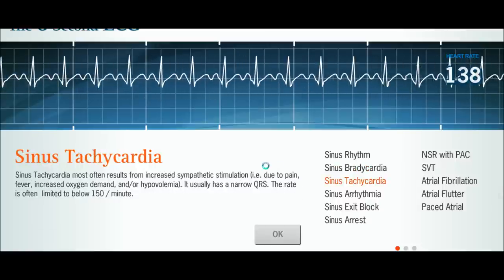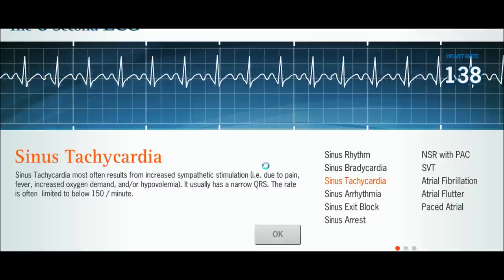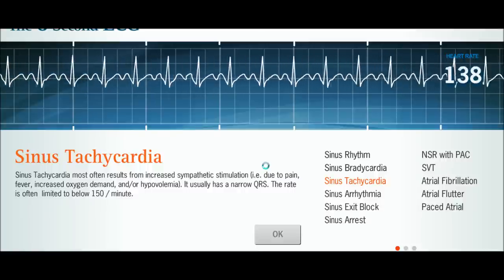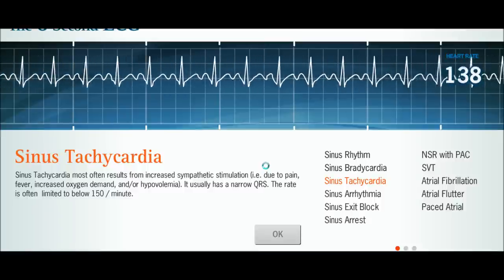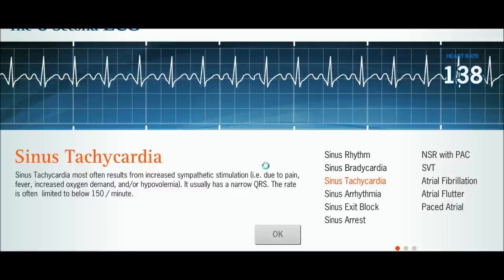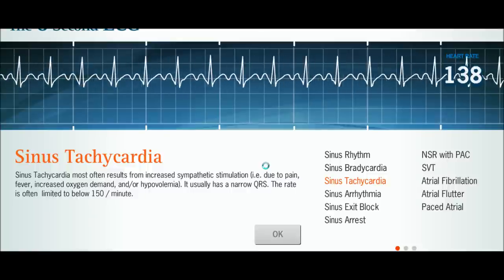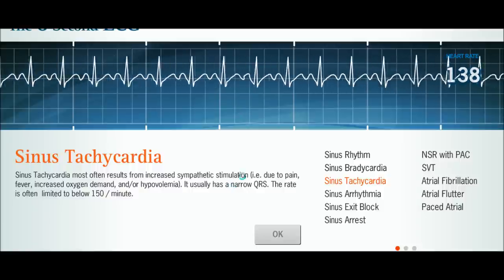To contradict that, we'll look at sinus tachycardia. This is just a fast heart rate — a normal sinus rhythm typically caused by increased sympathetic stimulation. That can come from pain, fever, increased oxygen demand, or hypovolemia such as dehydration. Note that we have a narrow QRS complex, and the rate is typically between 100 and 150 beats per minute.